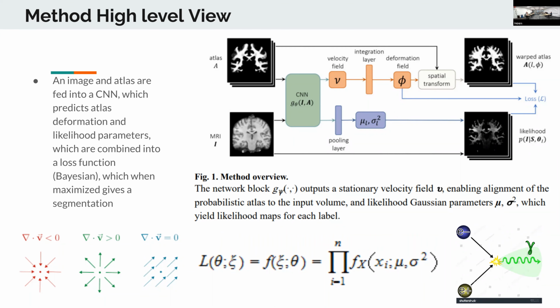But I think it's semantic. When I hear unsupervised segmentation, what I think is T1 as the input and label as the output, and you train it without the labels. Yeah. But here, there's a different task, which is how to correctly warp an atlas onto a subject's brain. So the problem they're solving is still atlas warp segmentation. It's still a segmentation job.